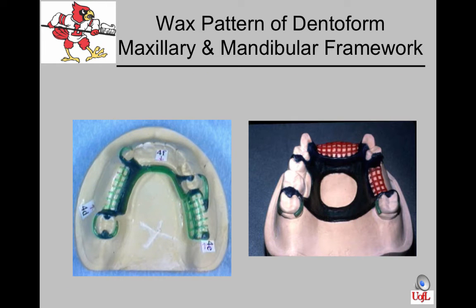These pictures show wax patterns that have been formed by our students. We used to wax up frameworks in this course. These are some of the nice patterns that have been done by them. This particular slide shows major connectors. Note on the right picture, the patient's right side has the major connector dipping down to avoid two of the posterior teeth. This area could have also been plated.